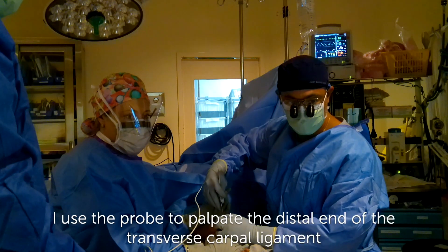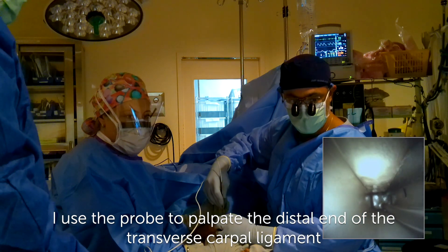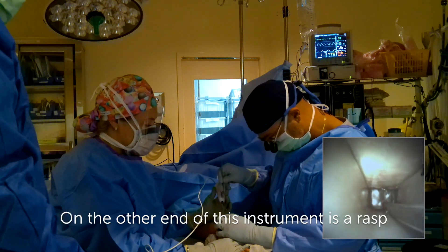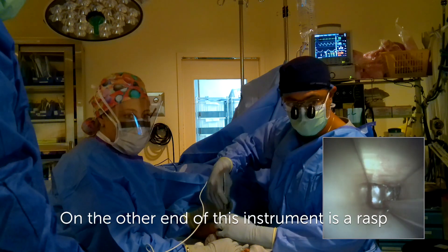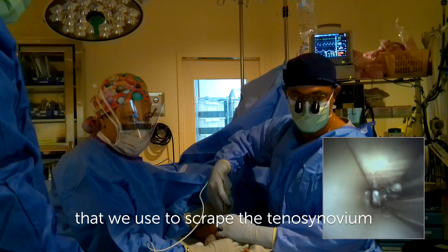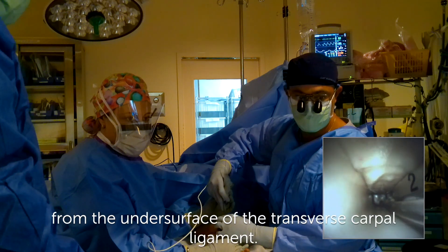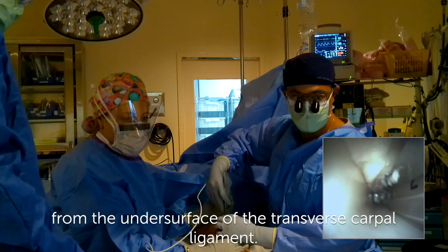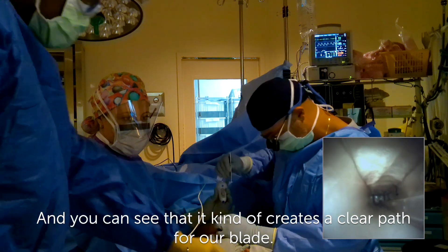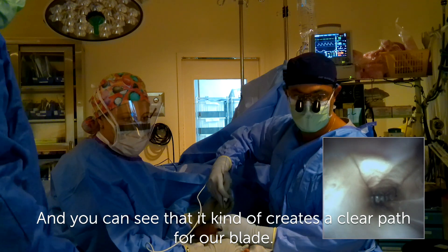I use the probe to palpate the distal end of the transverse carpal ligament, so you can clearly see it there. On the other end of this instrument is a rasp that we use to scrape the tenosynovium from the undersurface of the transverse carpal ligament. And you can see that it creates a clear path for our blade.